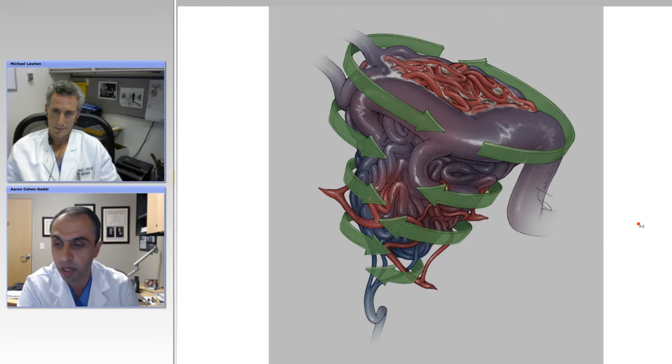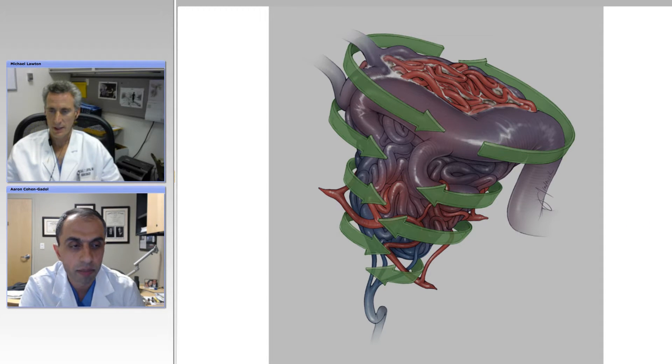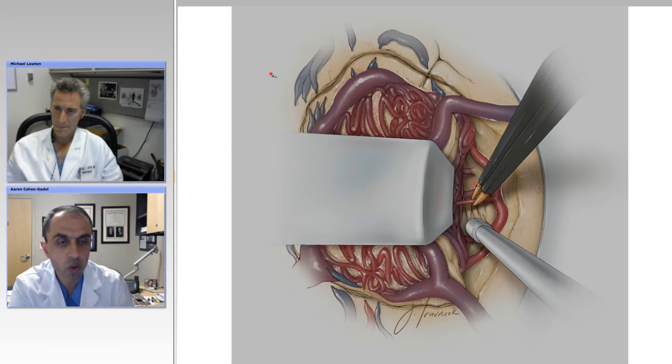Any other pearls to this point, Michael? Yeah, I think your illustrations are excellent. This one showing the circumferential dissection is very important — to really work all sides of the nidus, not just one or two or three spots, but steadily deepen the dissection. You don't want to get into deep holes where, if you get some bleeding, you'd have a tough time finding the bleeder. Going further deep along the margin between the arteriovenous malformation and the brain, coagulating feeders — some respond easily to bipolar coagulation, some burst, making management very difficult.